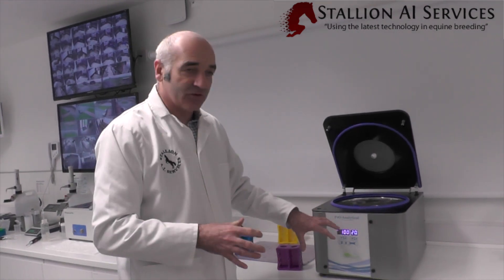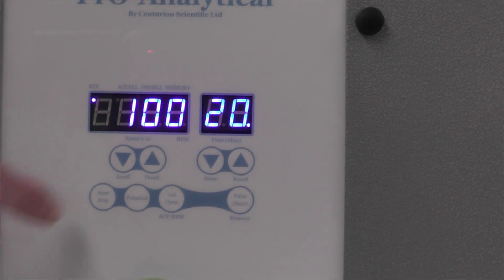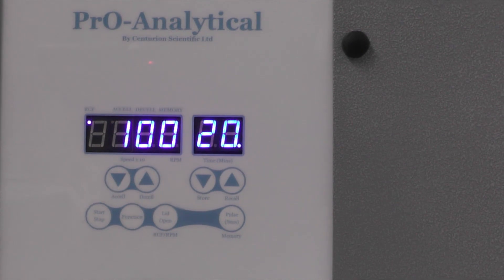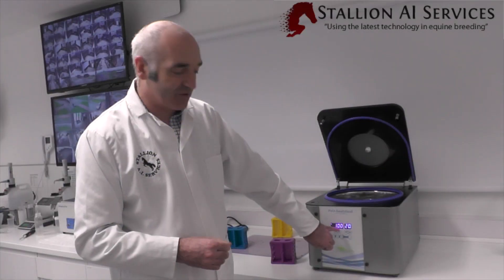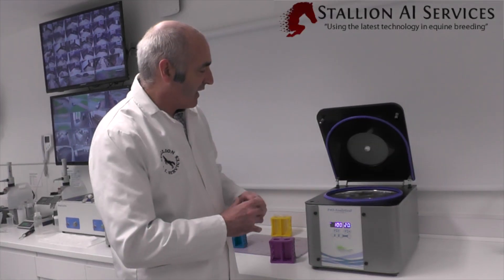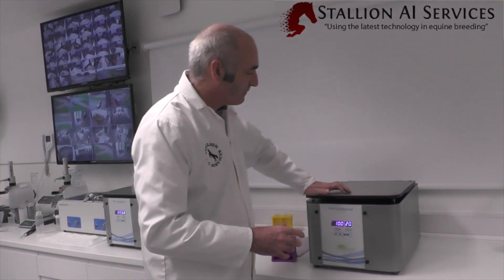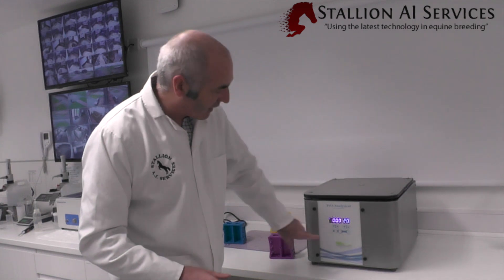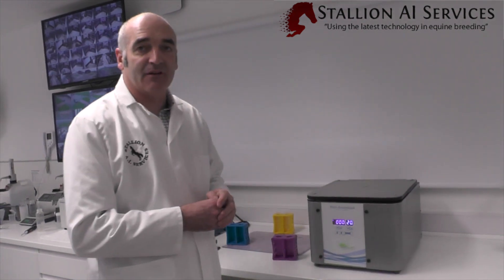If your centrifuge displays g-force directly, you can simply select whichever value you want. This specific centrifuge is times 10, so where it shows 100 it actually means 1000g. We set our 20 minutes, press go, shut the lid, then press start, and it will count down until it finishes.